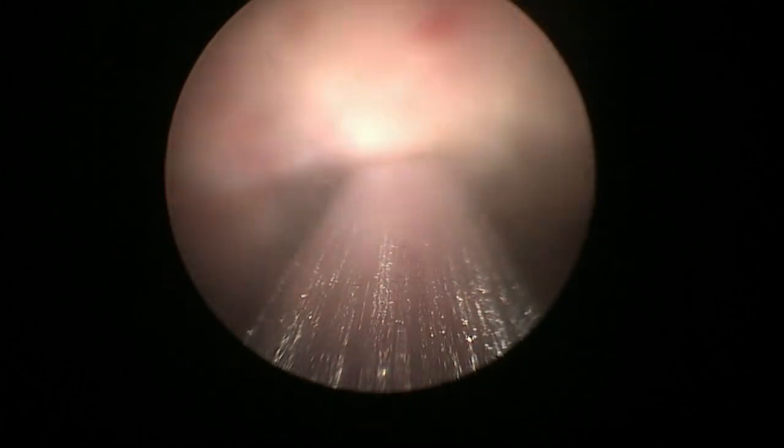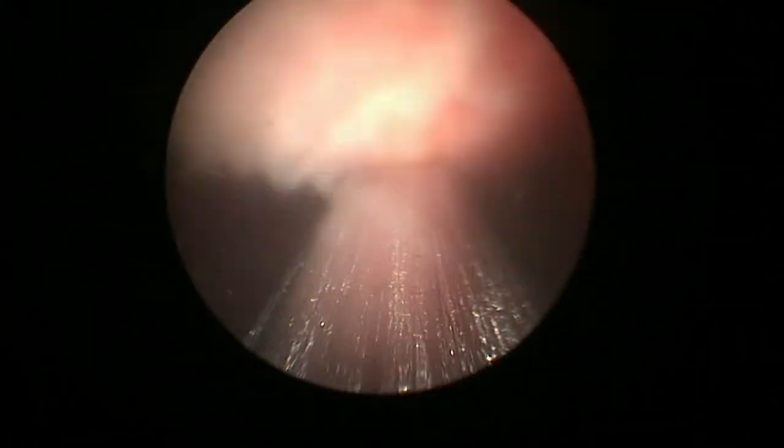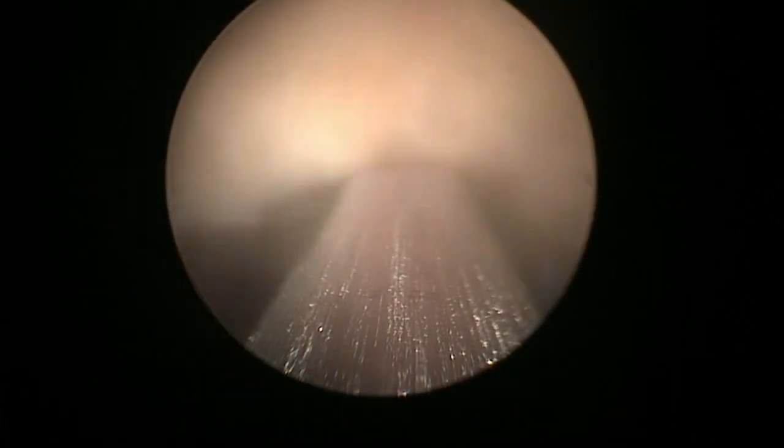Interestingly, this blade has no logo. And if I keep the blade at this distance from the telescope, I can have some information of where the bladder is. You see, I don't see it in detail, but I can see that the color of the water on the sides of the bladder is a little bit black, which means that there's no bladder tissue nearby. The morcellator has changed very deeply what we do, in the sense that before, sometimes morcellation would take longer than the enucleation phase, and now it tends to be very fast because this morcellator chews the tissue at a rate of 10 or 11 grams per minute.